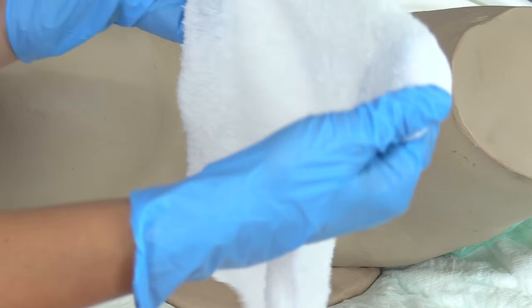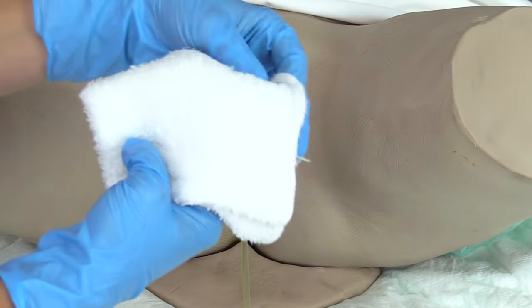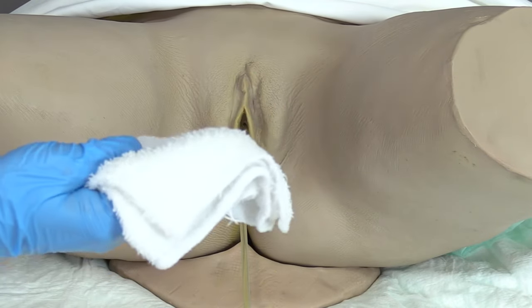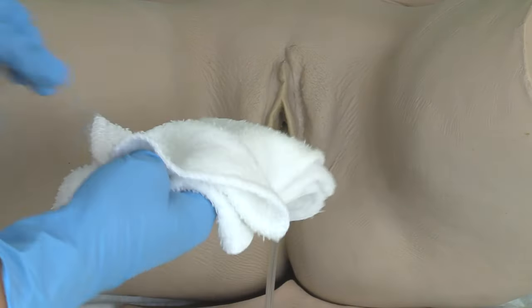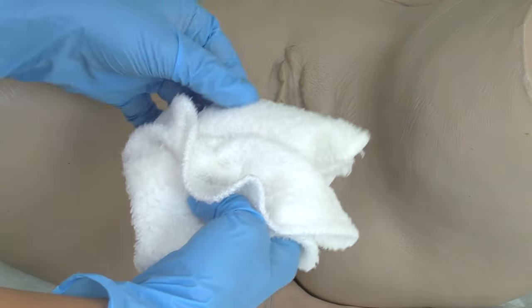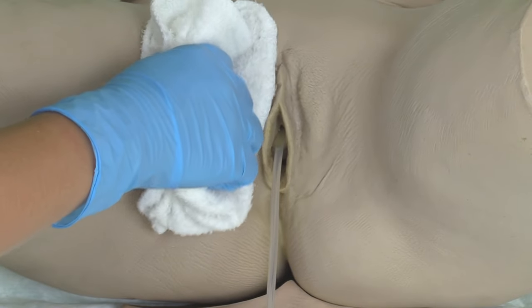So we have a washcloth that has soap and water on it. We are going to fold it in half, and we're going to create those four leaves. So each side will wipe another side without contaminating. So we're going to warn the patient, we're going to touch them and clean the inner thighs, going from top to bottom. We pull that leaf back, going to the side closest to us, that thigh, top to bottom, pull that leaf back, going to the other side, top to bottom, pull that leaf back, go the other side, top to bottom, and we have washed that area.